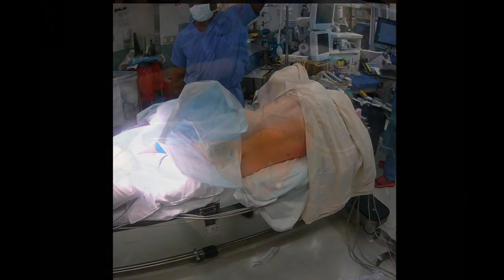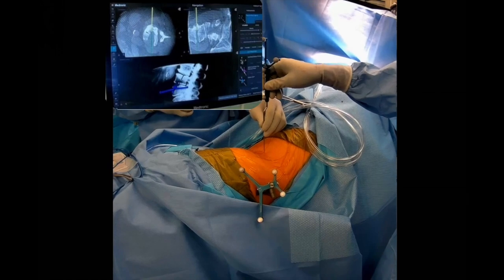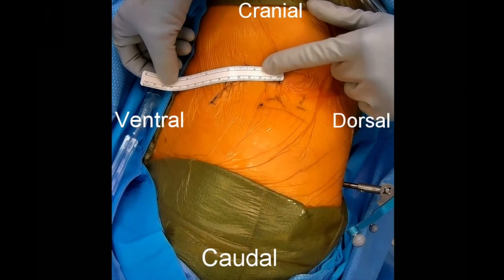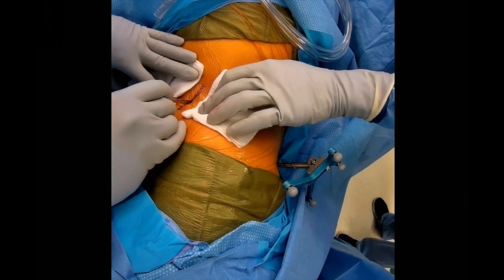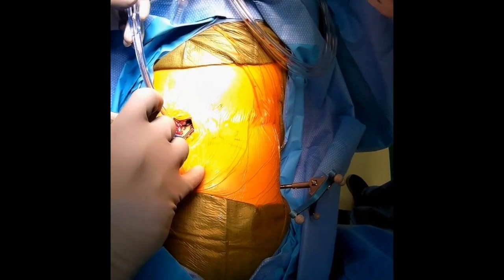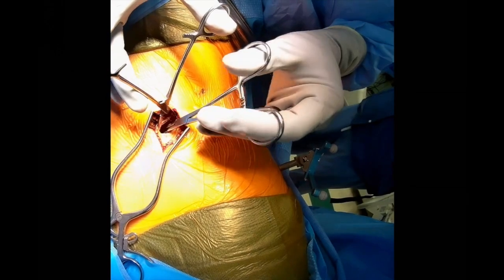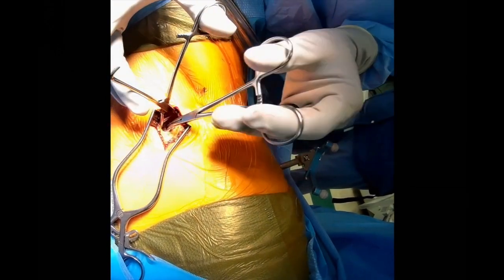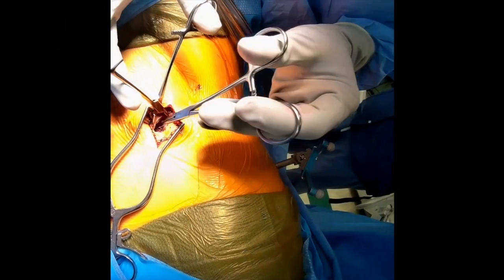The patient is positioned in the right lateral decubitus position. Using navigation, the midpoint of the vertebral bodies is identified. A ruler is used to measure five centimeters anterior to the midpoint — this is how the incision is planned. After opening the skin and the fascia, the muscles are dissected bluntly.